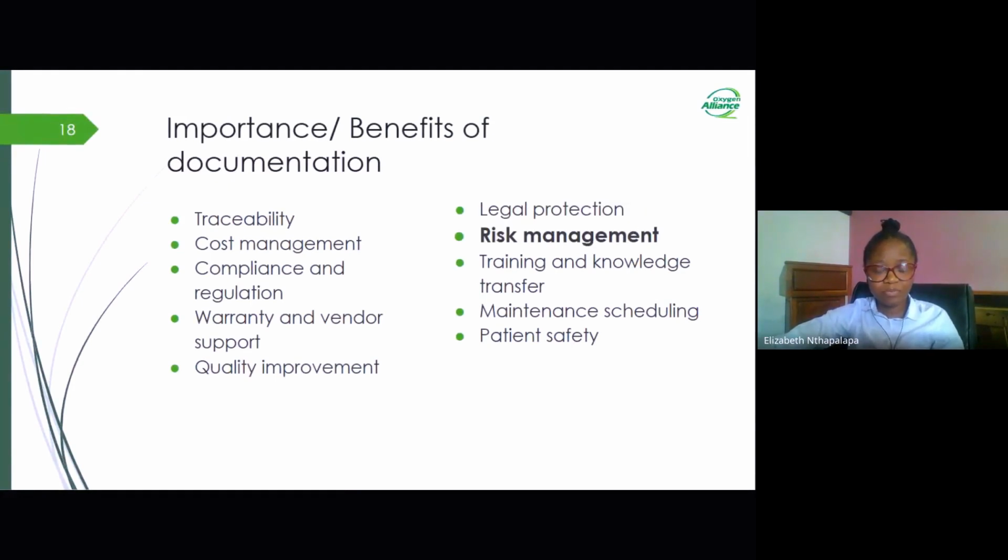And moving on, we have risk management as another benefit that we gain from doing proper documentation. Again, it helps the facility to identify and mitigate any kind of risk that can be associated with the medical equipment. And this facilitates that we should have a proactive measure to reduce those issues.